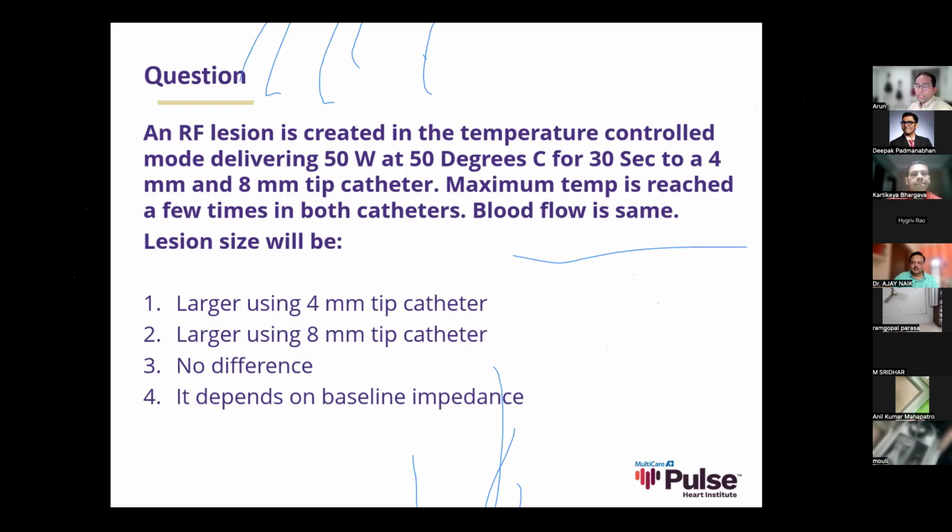So ultimately, we need to deliver wattage, and ultimately, we need to deliver the energy deeper into the tissue while keeping the surface very cool. That is the whole point. If you're keeping the surface cool, but you're not delivering more wattage by taking advantage of the surface being cool, then you're not giving any benefit to the tissue. I hope this question is a bit more, this is a bit more confusing, but maybe this will clarify that point.